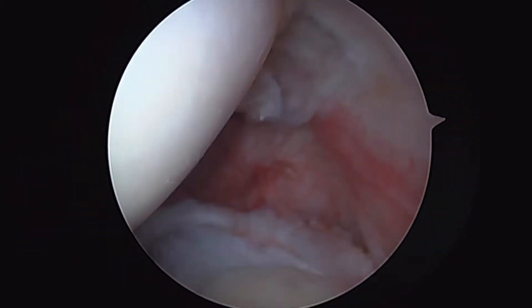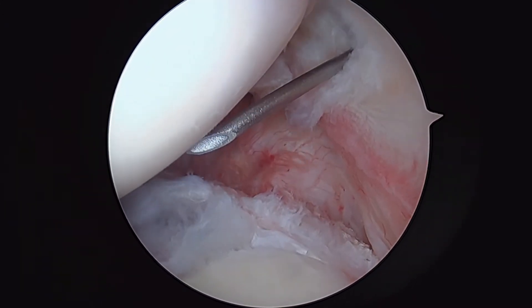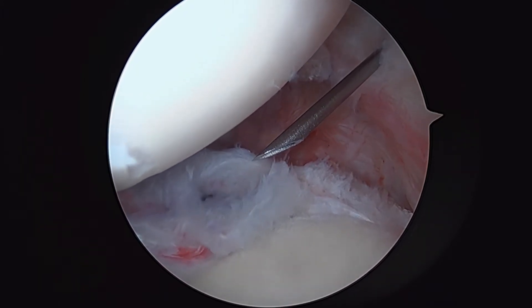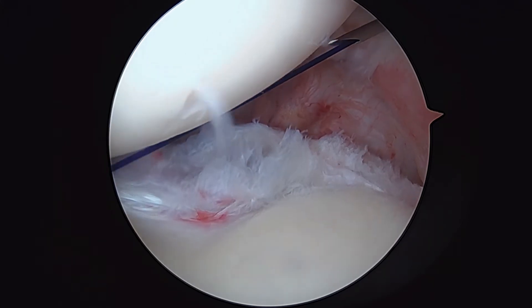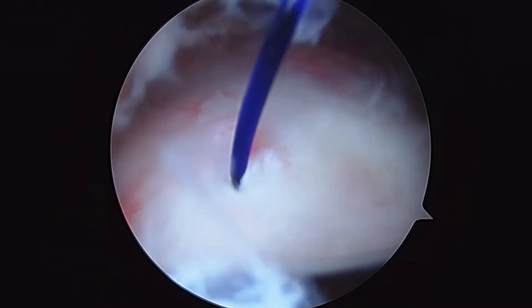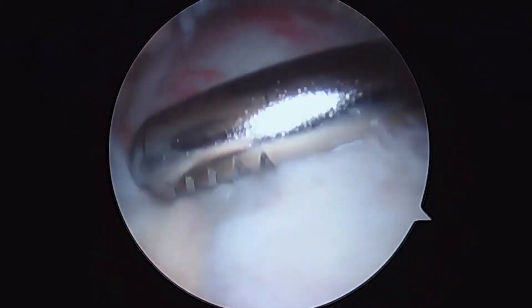Spinal needle. Here's our spinal needle coming through that area. We're going to pass a marker stitch, and then we're going to change positions with your shoulder and go into the subacromial space. There's that purple marker stitch coming in, so you can see how we do that. Now the next step is to back out the needle, and that just leaves that soft suture right there. You can see why we use this marker stitch — it's coming out right where the tendon's torn.